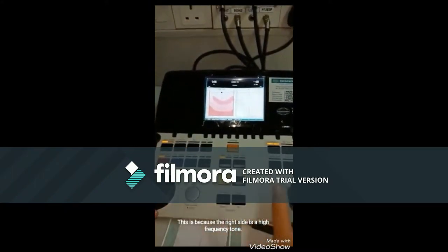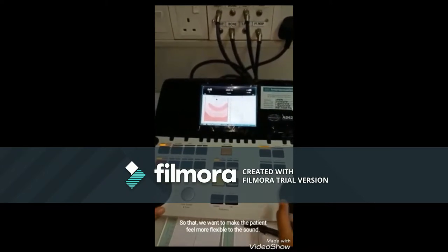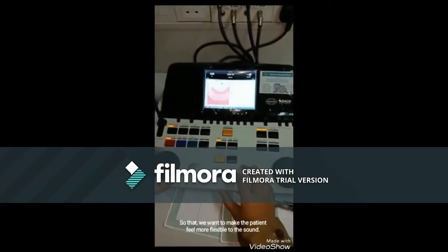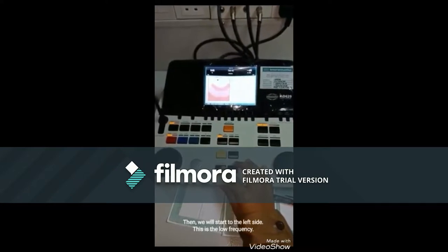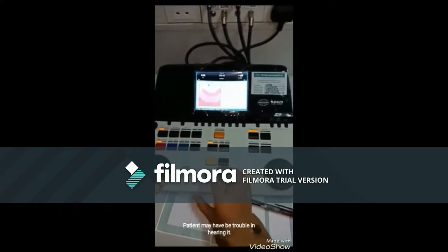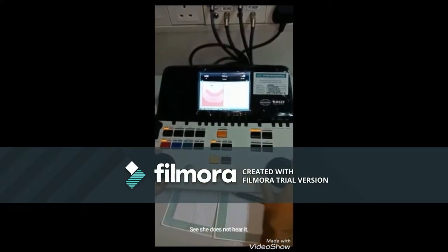This is because the right side is the high frequency tone, so that we want to make the patient feel more comfortable with the sound. Okay, then we will start with the left side. This is a low frequency, so the patient may have trouble hearing it. Okay, see, she doesn't hear it.